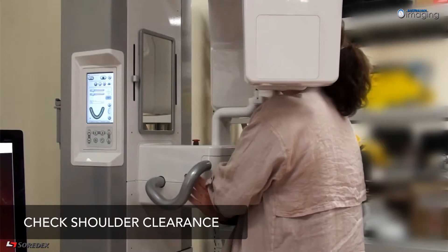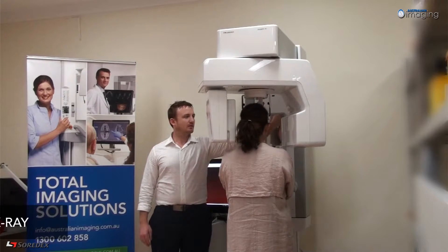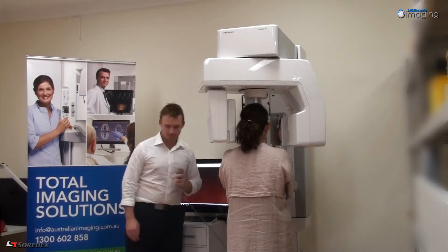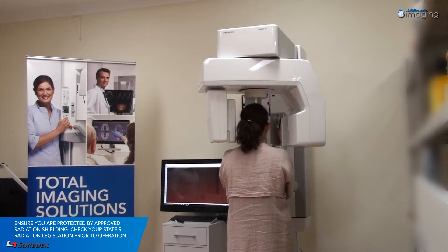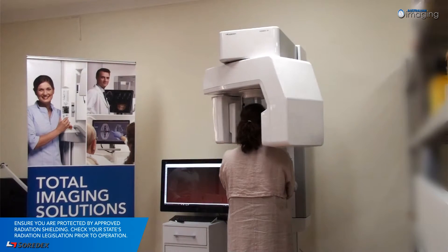Check the shoulder clearance and ensure the patient crosses their arms and holds the machine handles. Select your desired exposure level on the control panel, protect yourself from radiation, and then press and hold down on the exposure button. During the exposure, you will hear a high-pitched beeping sound and the exposure warning symbol will appear on the control panel.